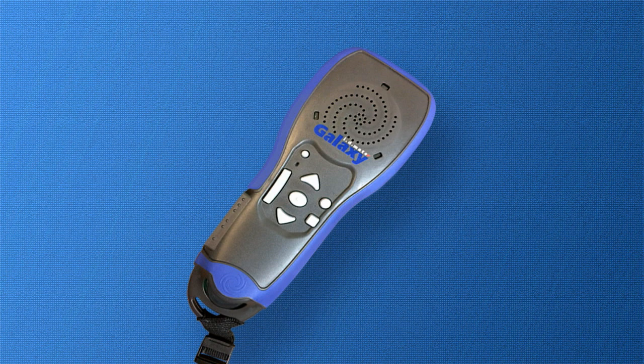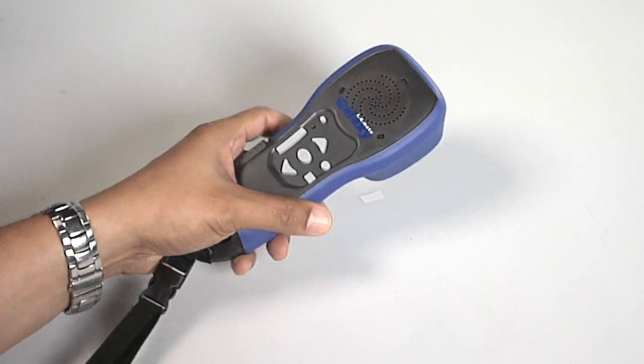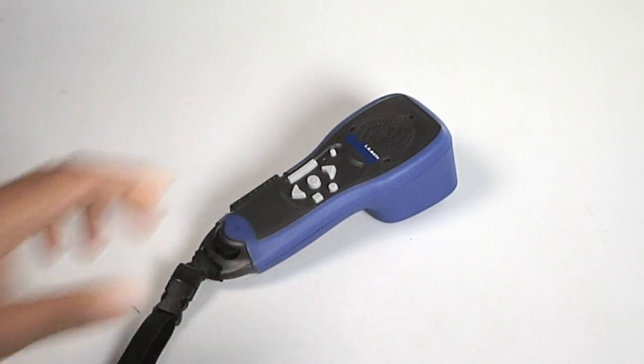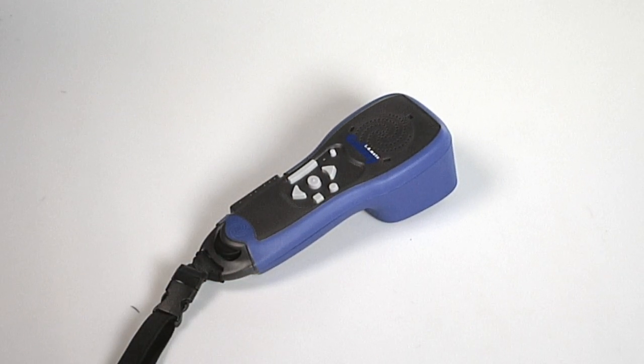Now that we know the location of the buttons, let's get started on scanning and accessing additional information about products. First, we will need to power on the device. Press the power button. You should hear multiple beeps and then a musical tune.